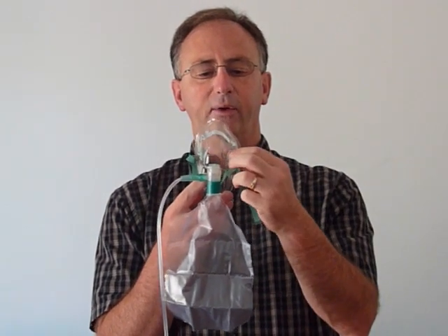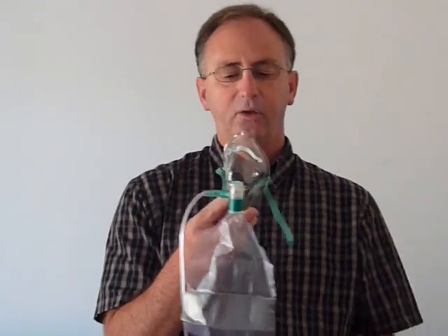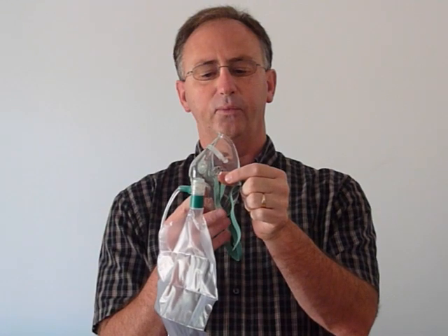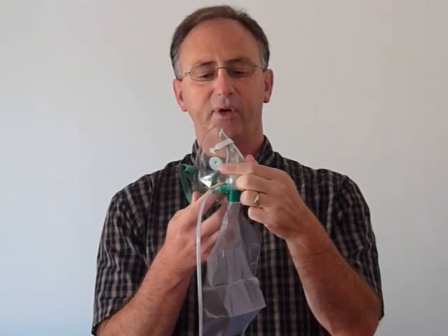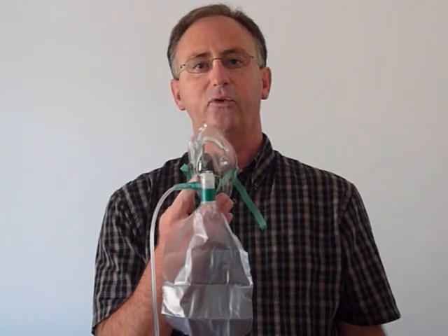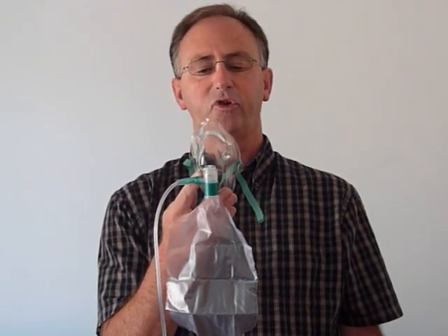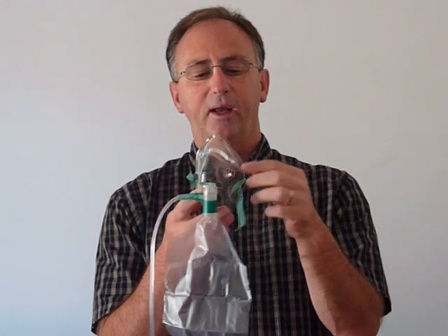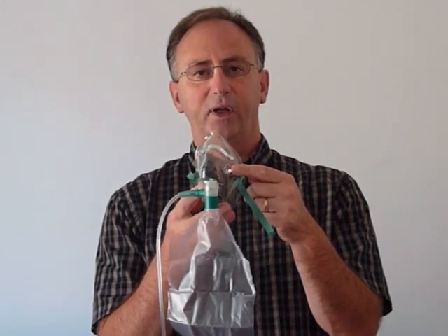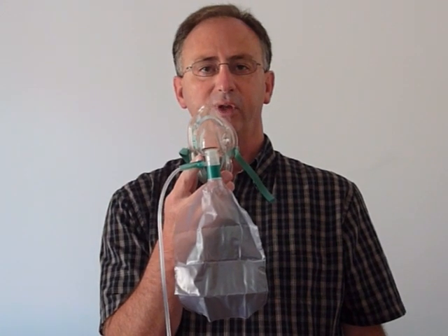The next mask simply has one valve removed so that you have an open air inlet for room air as well as a closed valve for when the patient breathes. This is our 2101 adult partial non-rebreather mask. There's a valve inside the mask, one on the outside, and an open valve so that if you ran out of oxygen the patient wouldn't suffocate.